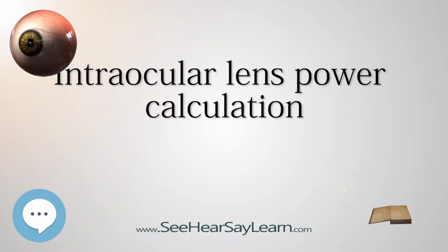In order to determine the power of the intraocular lens, several values need to be known. The eye's axial length, AL. Corneal power, K. Postoperative IOL position within the eye, known as estimated lens position, ELP. The anterior chamber constant, A constant or another lens-related constant. Of these parameters, the first two are measured before the implantation, the third parameter, the ELP, needs to be estimated mathematically before the implantation, and the last parameter is provided by the manufacturer of the intraocular lens.